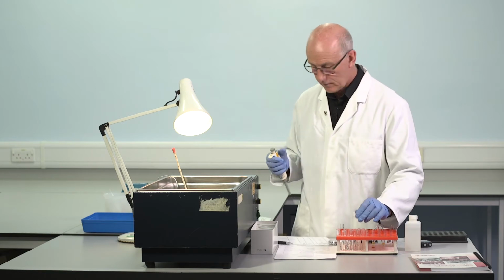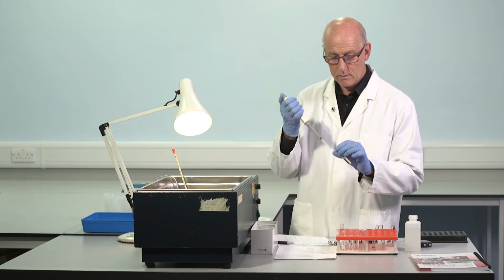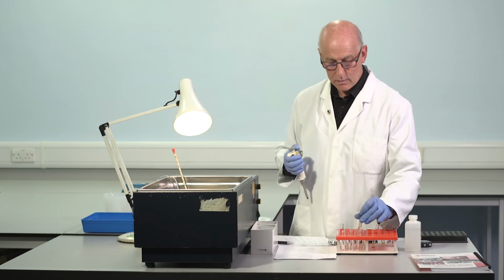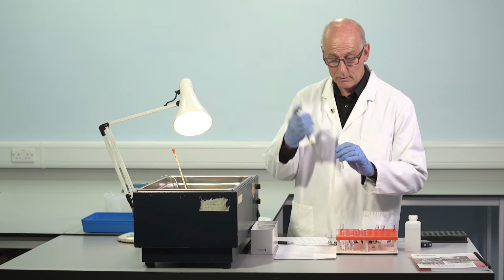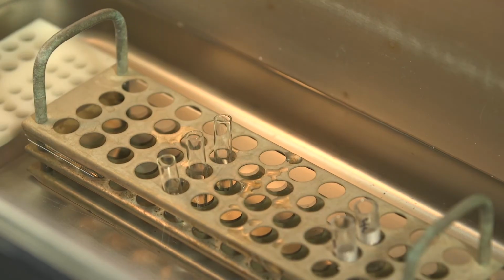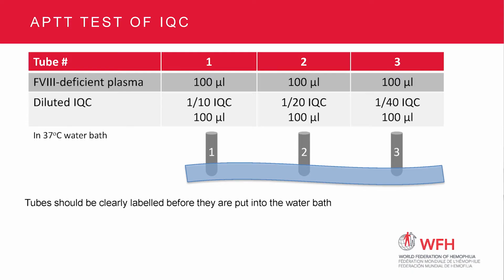First tube. One in 20 dilution. Second tube. 1 in 40 dilution. Third tube. And mix. In some centres, we noticed from surveys of practice that the quality control material is not assayed at 3 dilutions, but just using a single dilution.